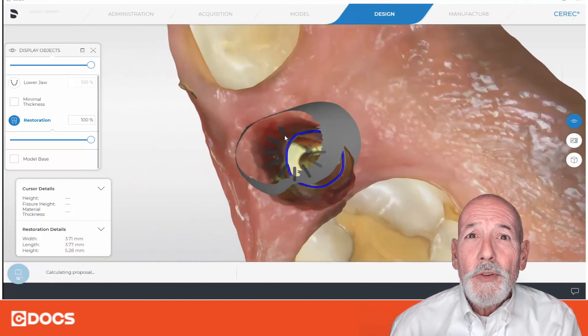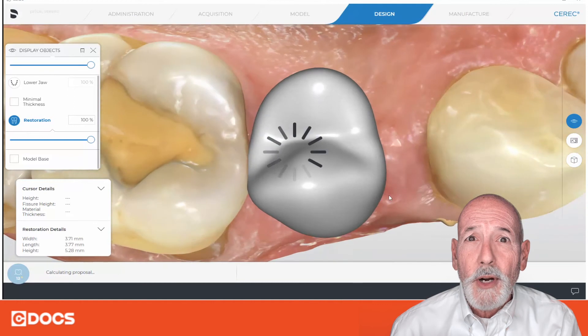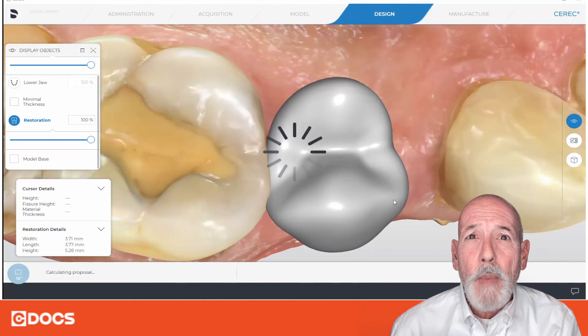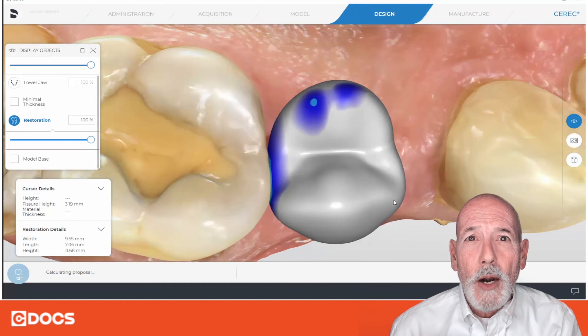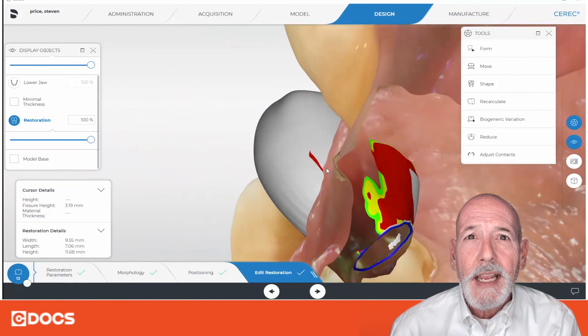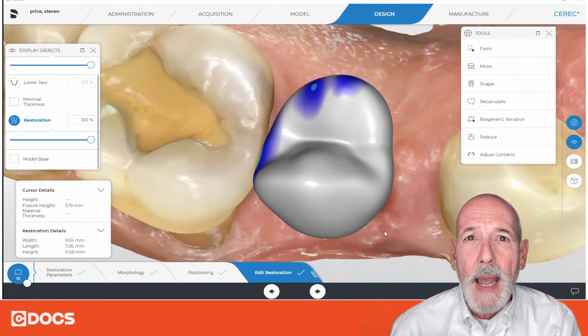So when you start looking at different things that may be giving you a strange proposal, you may want to look at your margin. There may be some kinks in it, or it's diving down a microscopic hole — as I say, it's gone down the rabbit hole. Redraw the margin, but don't do it in bits and pieces; reset the whole thing. A lot of times you'll be able to go ahead and get a better proposal right off the bat.